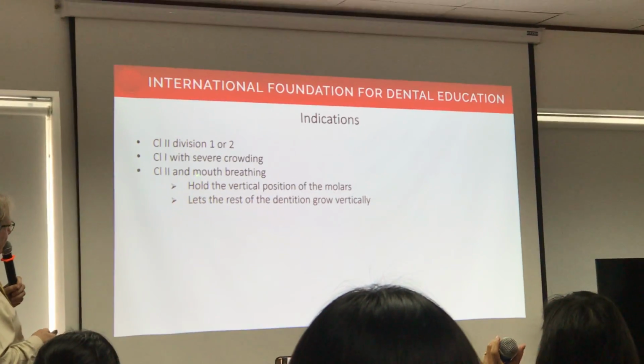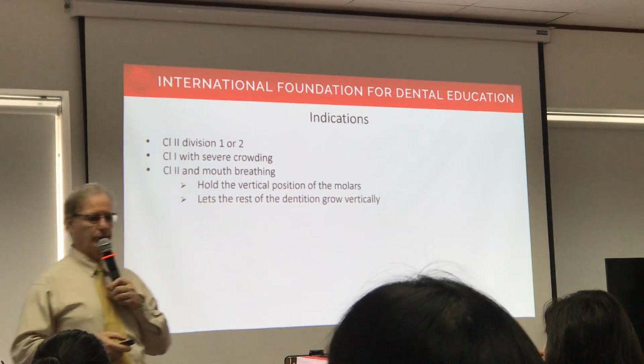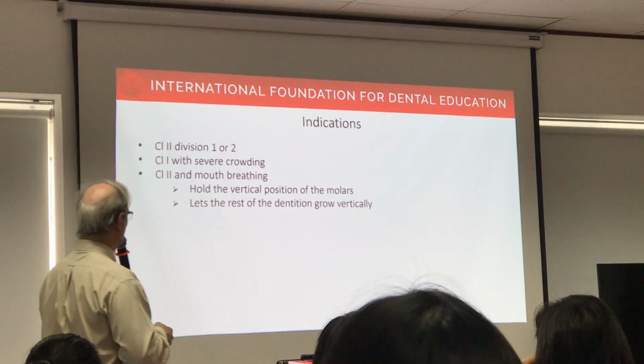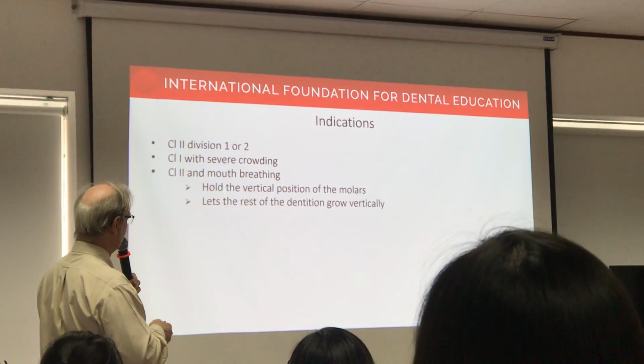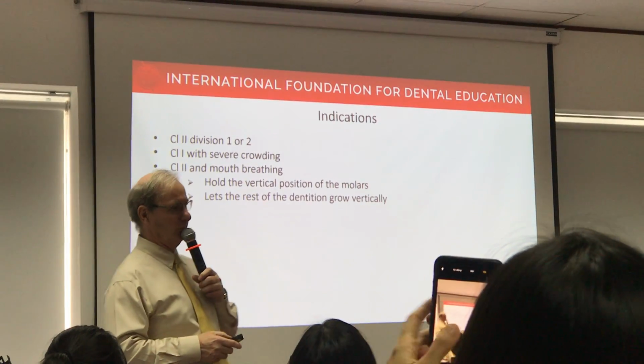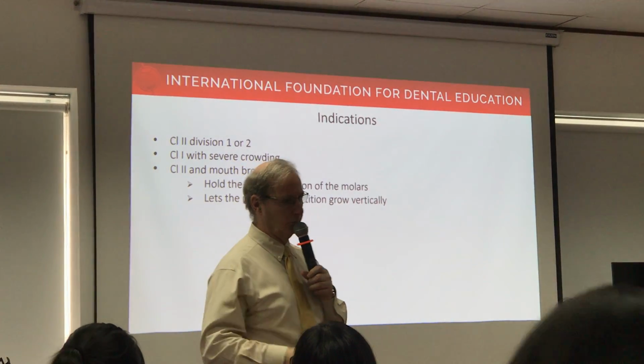And I use them for mouth breathing. It's a new thing now. Sleep apnea, the whole thing is the new gizmo in life. Okay, so because usually mouth breathers tend to erupt their molars, it's really cool because you hold the position of the molars in a vertical plane. So use a high pull headgear, not a low pull headgear.